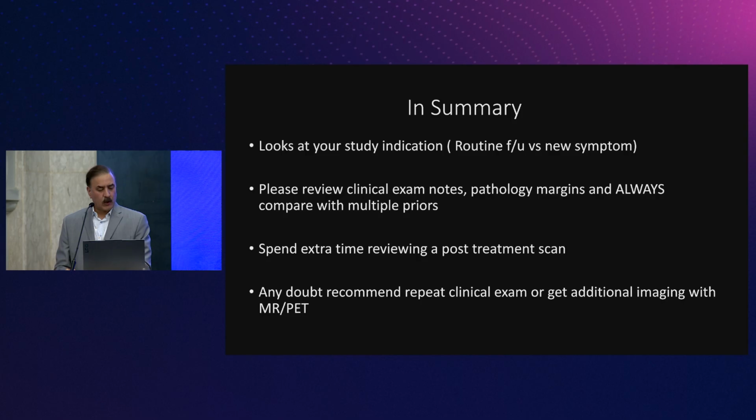So in summary, look at your study indication, routine follow-up versus new symptom, review the clinical exam, look at the pathology, and always compare to multiple priors, which will be very, very helpful. Spend extra time reviewing a post-treatment scan as you would for a routine neck scan.